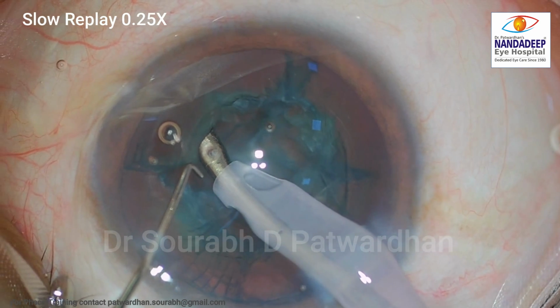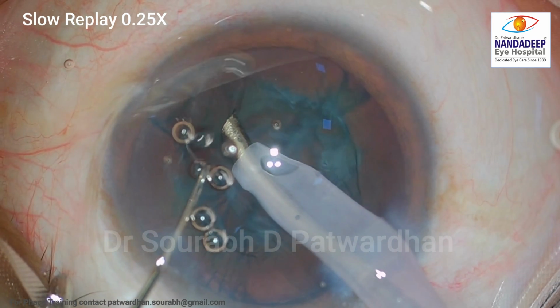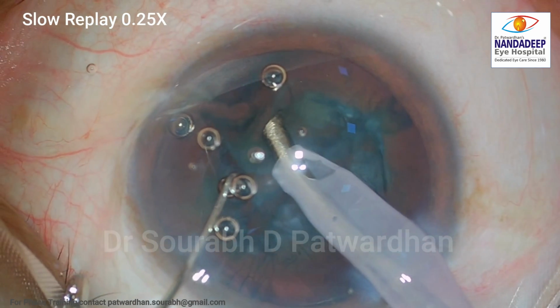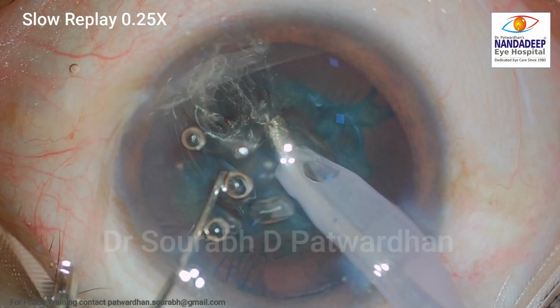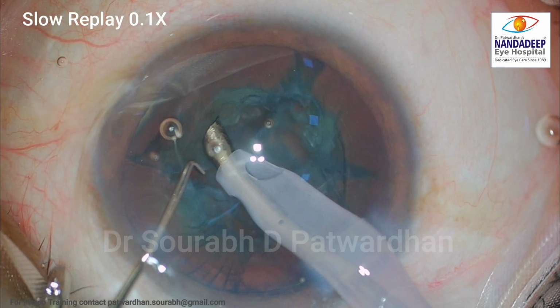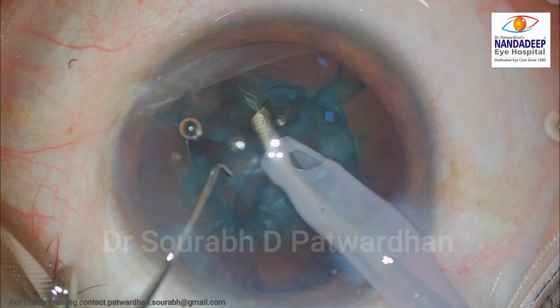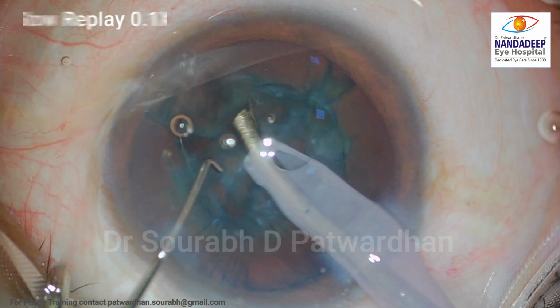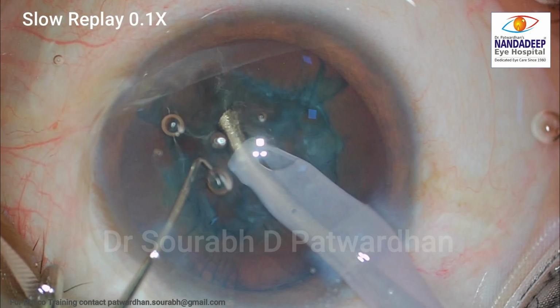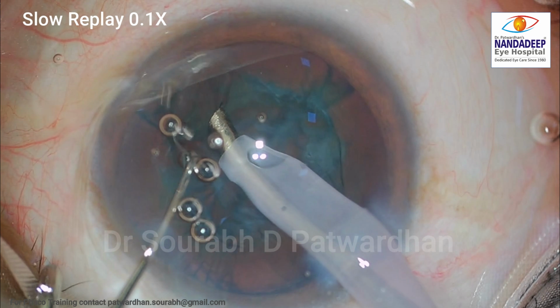So I slowed it further down and tried to see whether giving phaco energy was producing any bubbles or not. When I slowed it down considerably to 10 times, I found that the first bubble which came out appeared to come from the phaco tip itself, but it was just a tiny bubble. Maybe I might have missed it in the sleeve, but then the rest of the bubbles were definitely coming from the sleeve, which was basically carrying the irrigation from the bottle. And then the gush of air also came out from the sleeve.